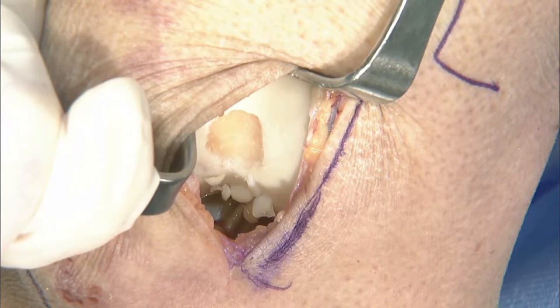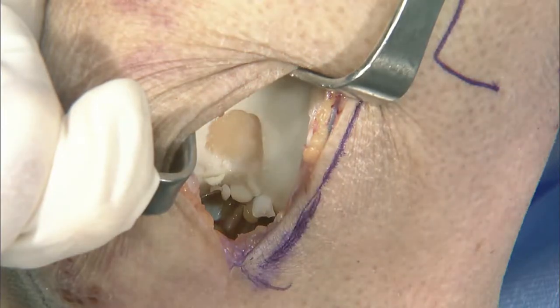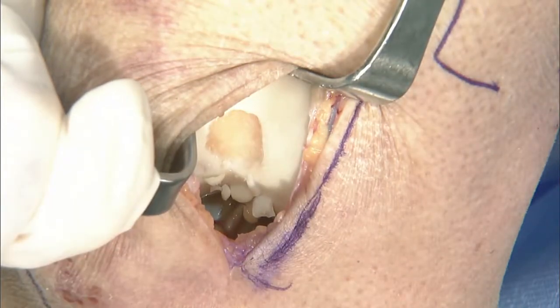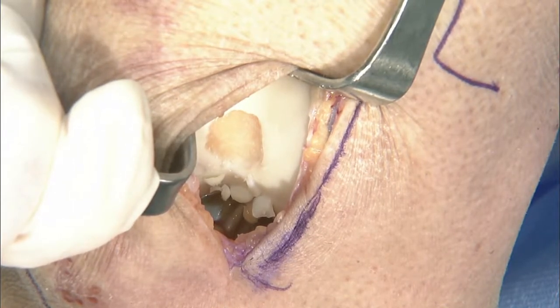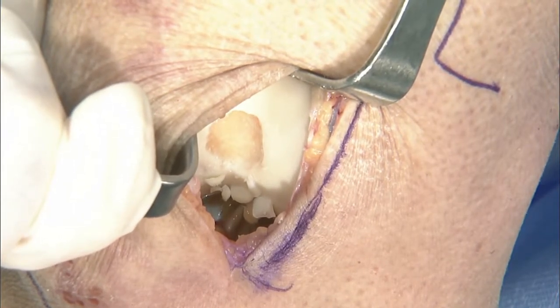Yeah, I completely agree. There's certainly talk about putting small anchors at the periphery if there's a significant amount uncontained, or anchoring it to soft tissue with a suture. But again, like you said, I haven't personally run into that, but I know people that have done that approach and were happy with it.